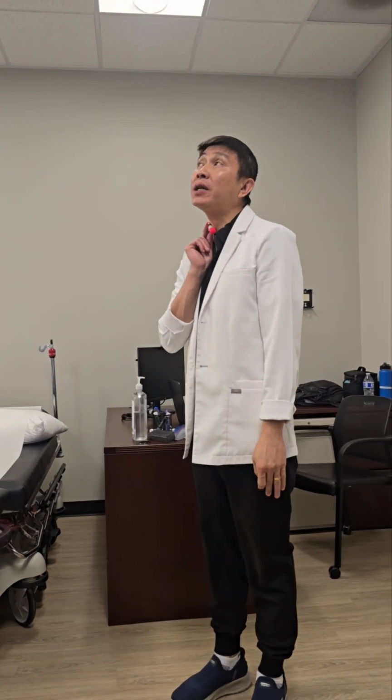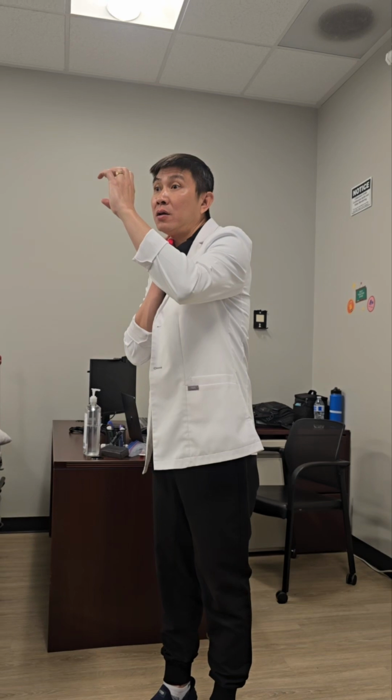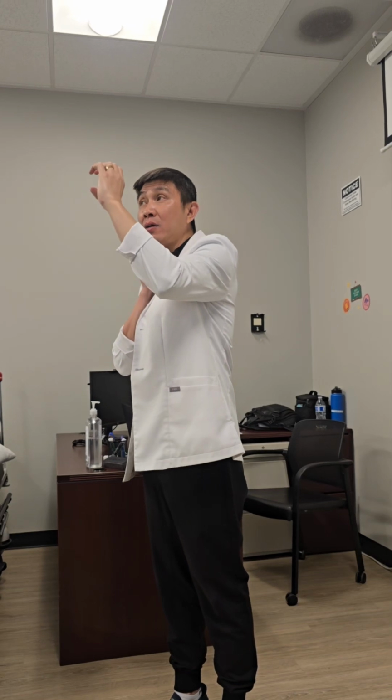So from the mid here, you sweep up, still transverse, until you see the CCA get larger. When the CCA gets larger, you know that is the bulb. So when you see larger, you pause and go back to the normal diameter. This is going to be considered distal.